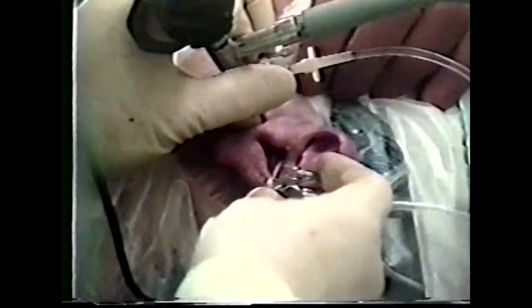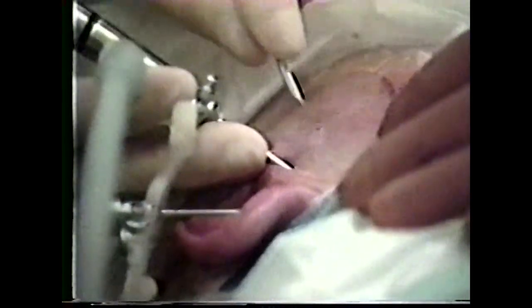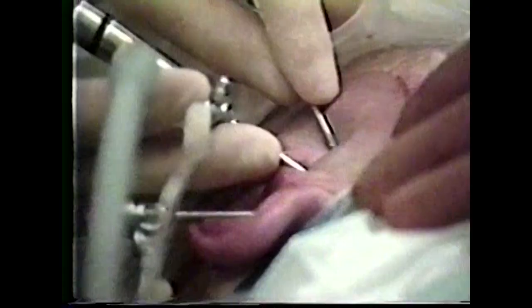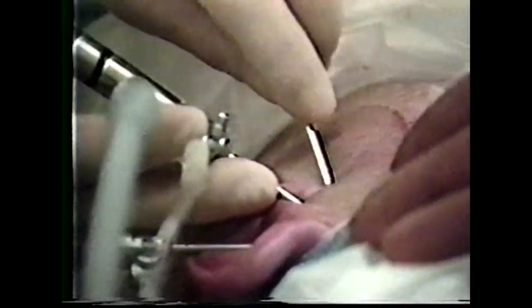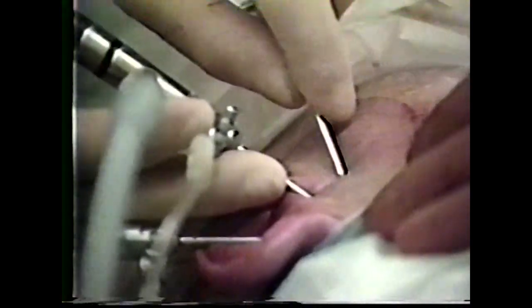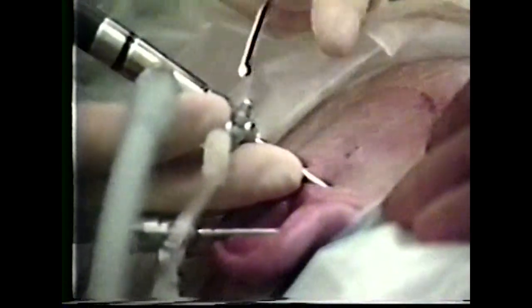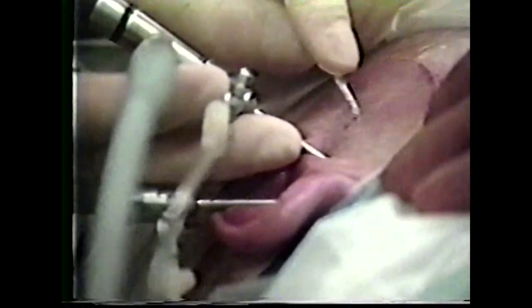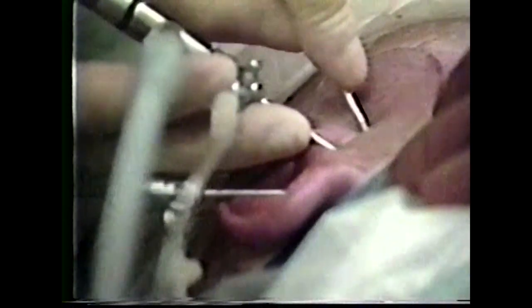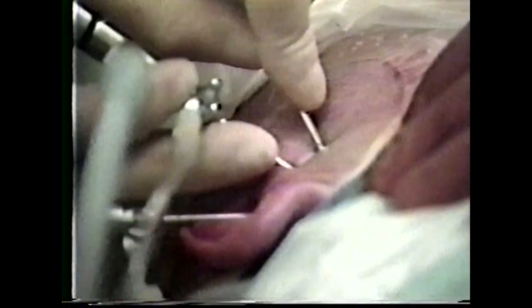With outflow closed off, the joint is distended, and a third 30-degree cannula can be introduced into the anterior lateral joint space. With constant distension provided by irrigating through the arthroscopic cannula, the third 30-degree cannula and trocar can be inserted into the anterior lateral joint space. This should be directed along the anterior slope of the articular eminence.